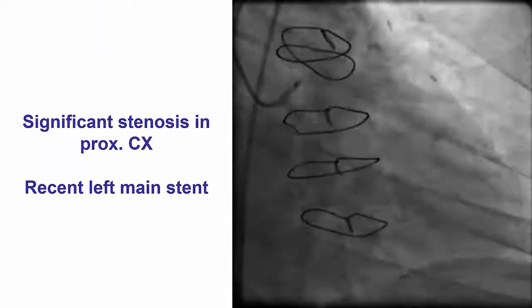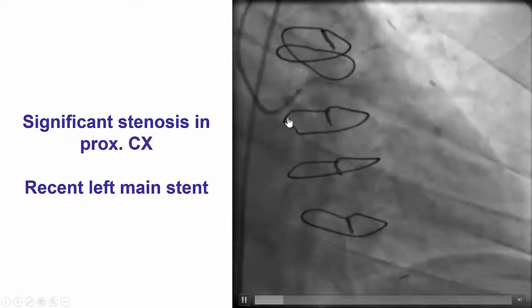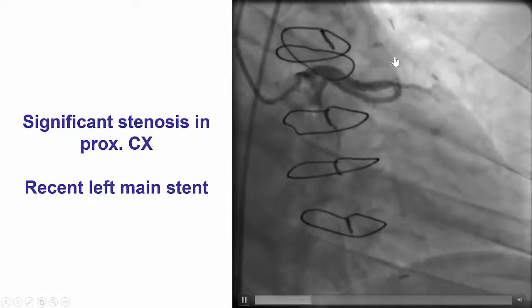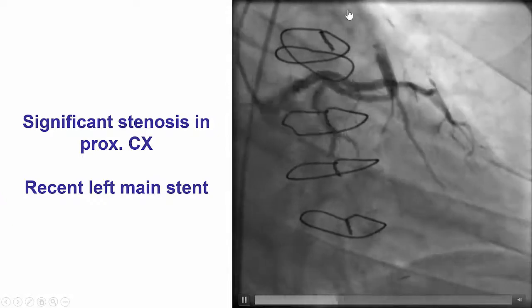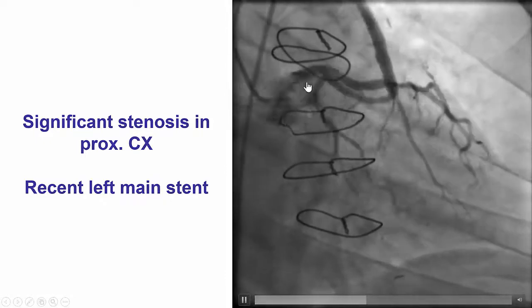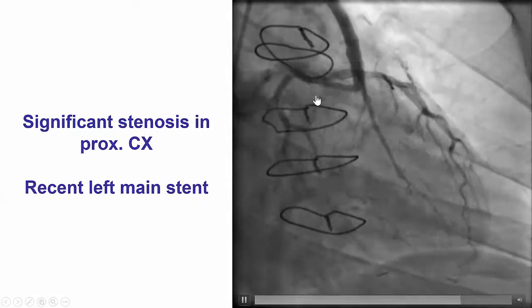The patient presented with angina and was found to have a proximal circumflex lesion. He had previous coronary bypass graft, and a few days earlier he was found to have an atretic LIMA and a patent vein graft to the Ramos branch. He had severe disease in the left main which was successfully stented, with the left main stent protruding into the LAD.